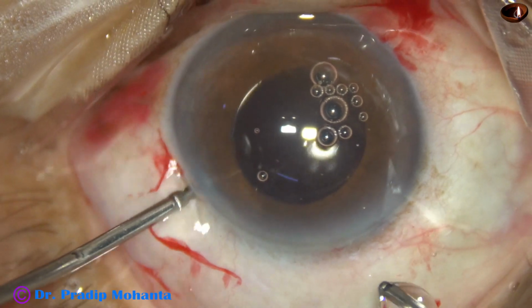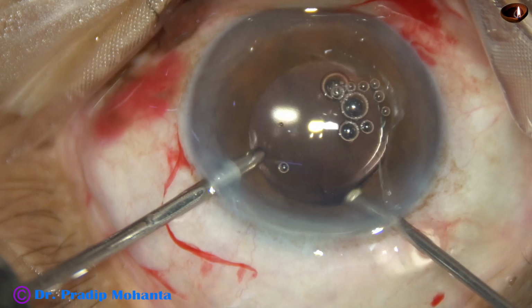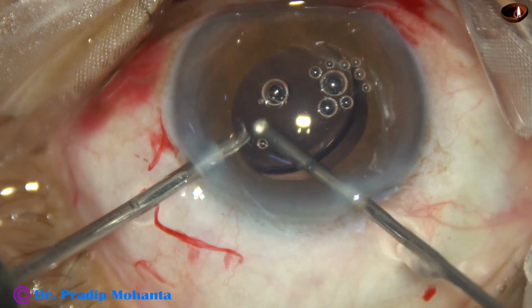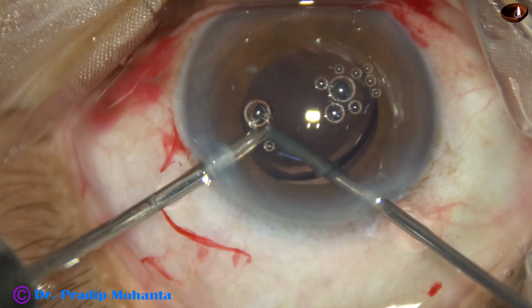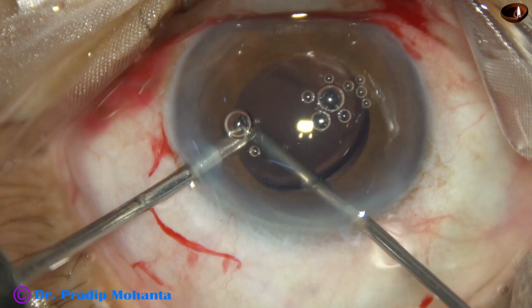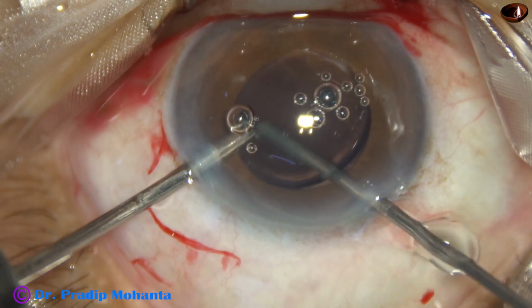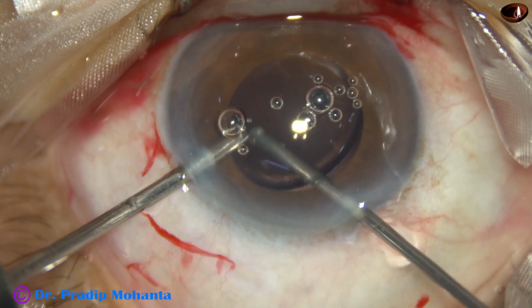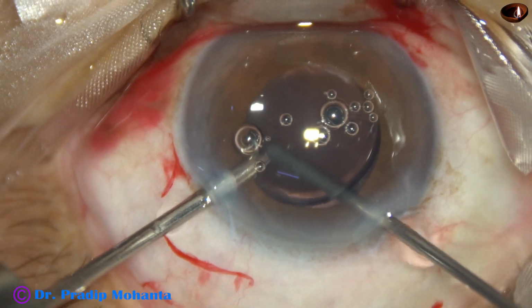Now the cutter goes behind the lens and some amount of anterior vitrectomy is done. Only just trimming of some vitreous strands just behind the intraocular lens.